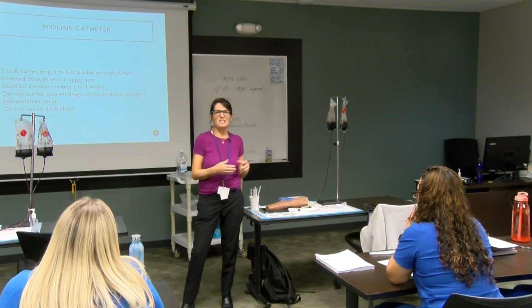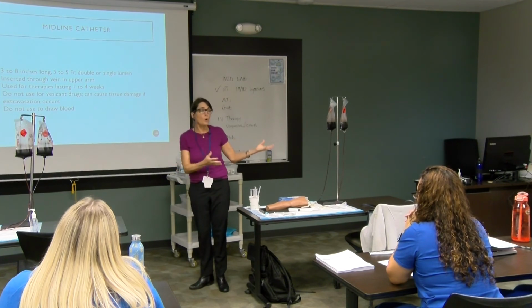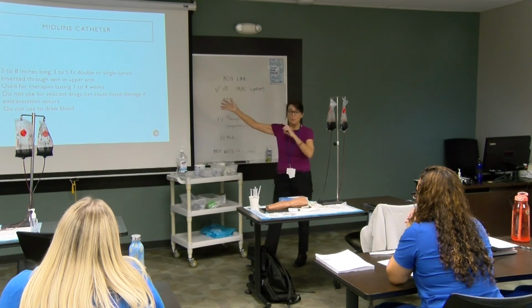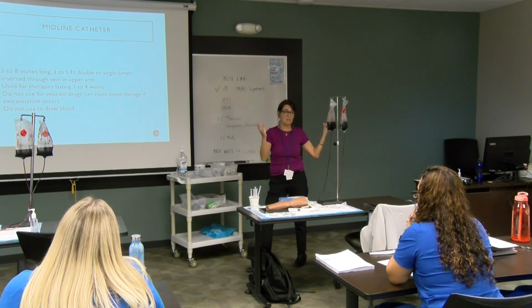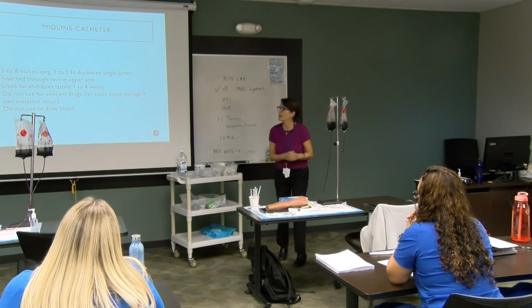Yeah, 72 to 96 hours. Always go by the policy, and of course, by your IV site assessment, which is what we'll be looking at. But the advantage of the midline catheter is that it can stay in place for 1 to 4 weeks.